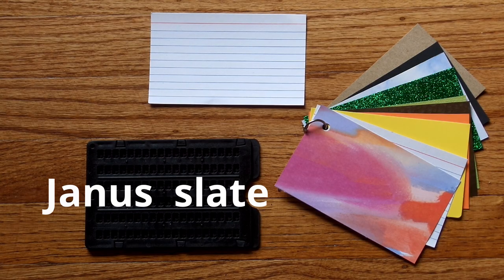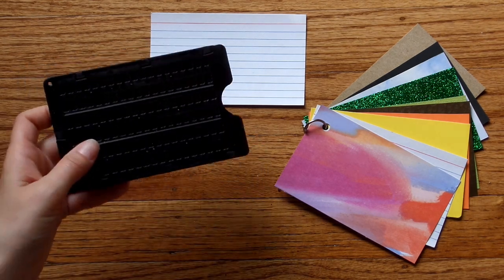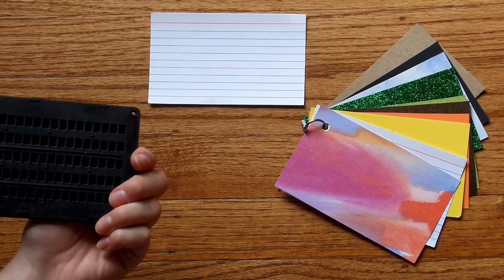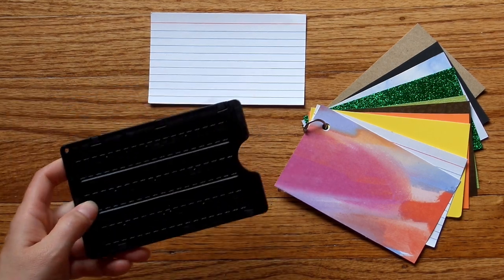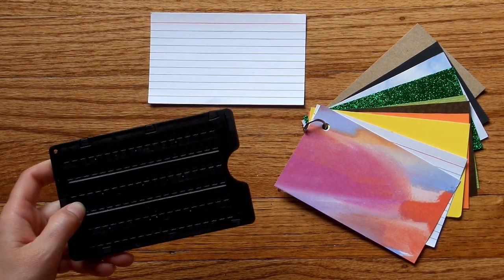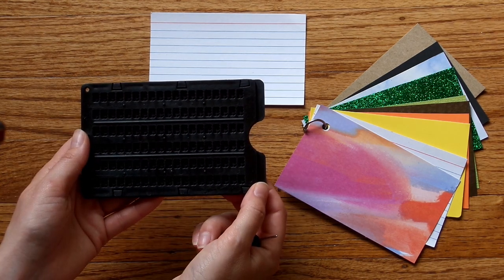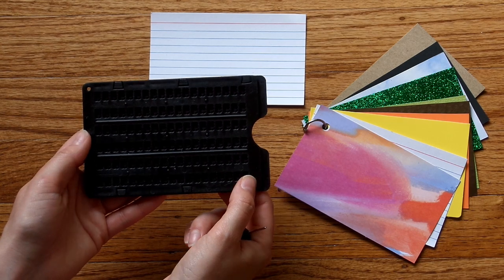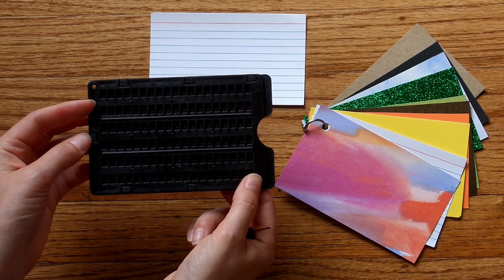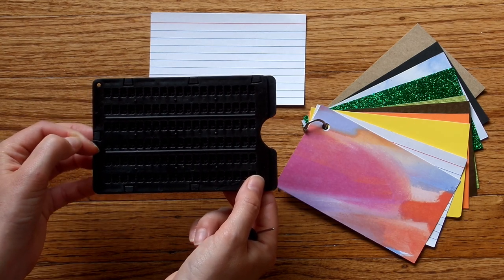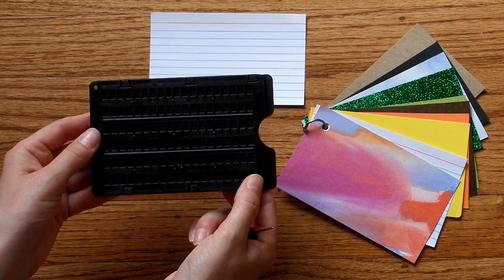The next slate I want to show you is the Janus slate, and what's so special about it, it is an interpoint. Well, basically. So interpoint means that there's braille on both sides of the page, and they're slightly offset. So technically, this is not an interpoint. It's actually double spaced, and the way I can tell that is that there's a lot of space in between each line of text, whereas if this was an interpoint, it would be a lot closer together.